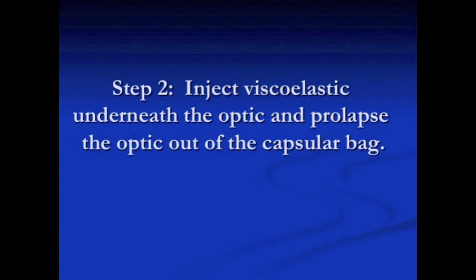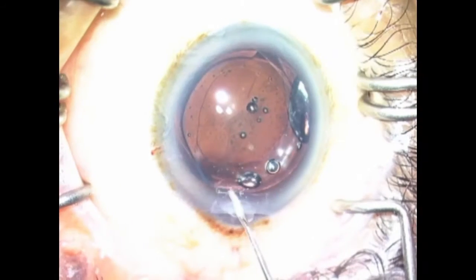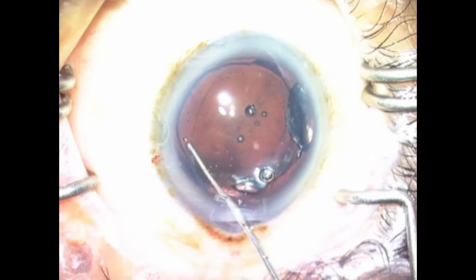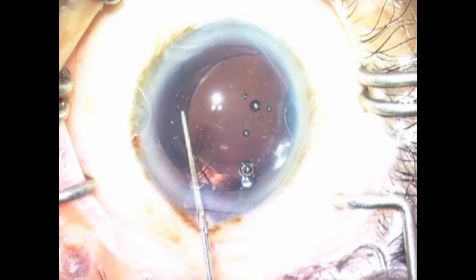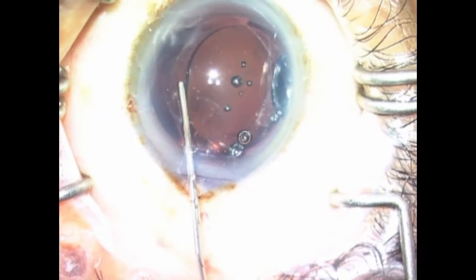Step 2. Inject viscoelastic underneath the optic and prolapse the optic out of the capsule or bag.